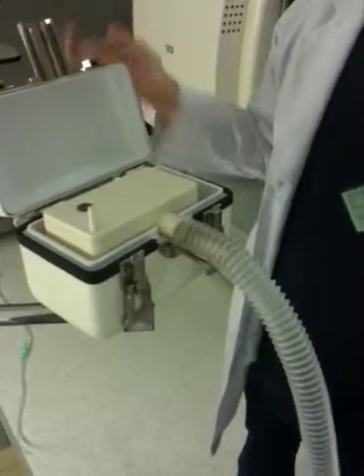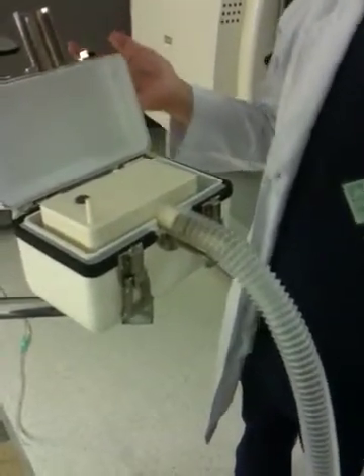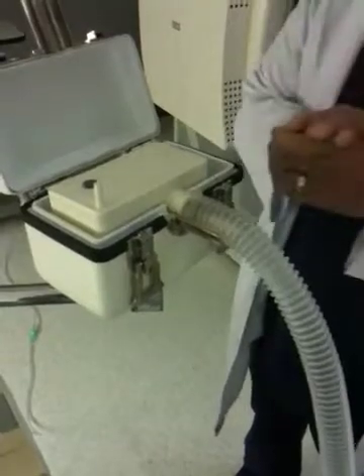2 mL of DTPA — which is about 20 mCi delivered. Because when you make 25, the maximum you can draw out is maybe 22. You're lucky if you draw out 25. You can make 30, but when you have short supply, 25 or 20 should be enough. So always make a minimum of 25.